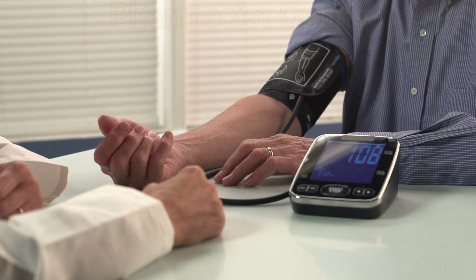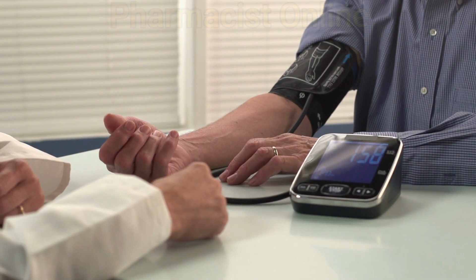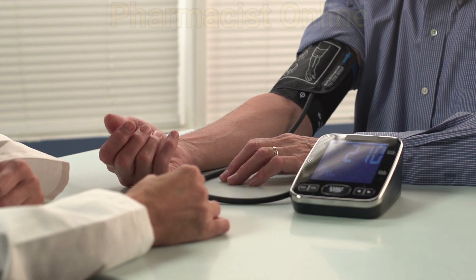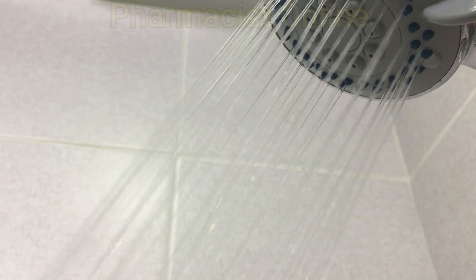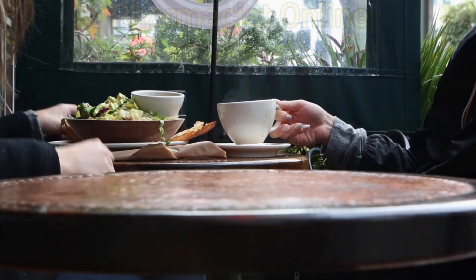While using a digital blood pressure monitor to get the most accurate BP readings, avoid some activities. Avoid taking a shower before BP measurement because it will affect the readings. Taking BP readings immediately after a meal will also show high BP readings.